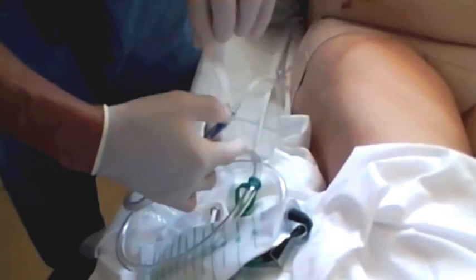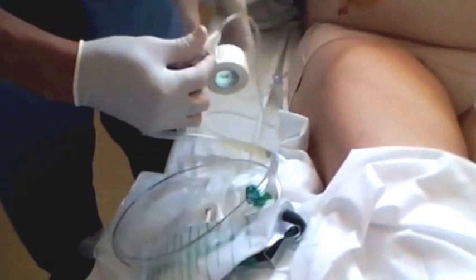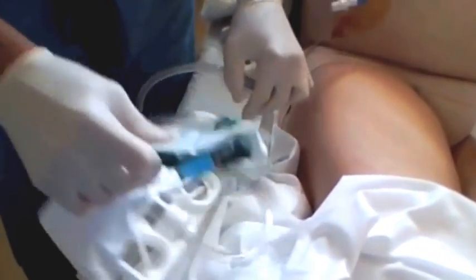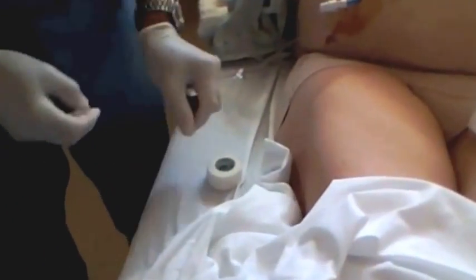Open the stopcock at that point and you can see the drainage of fluid coming out. The tube is taped into place. I tend to take the bag and instead of hanging it off the stretcher, it works better to drain it onto the floor — just drop it right down. It can fill up better down there with more gravity. The next thing is to tape the catheter into place so that if somebody trips over the bag, they don't inadvertently pull the catheter out of the patient.